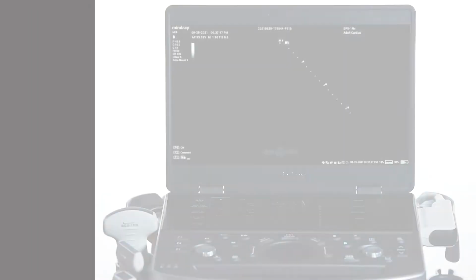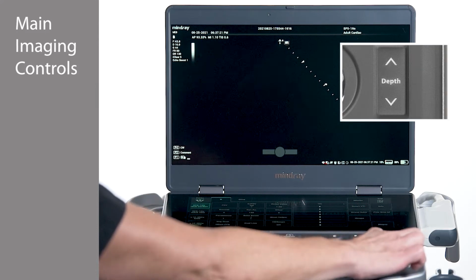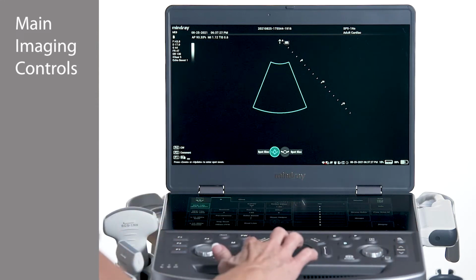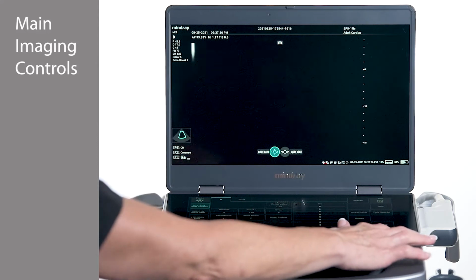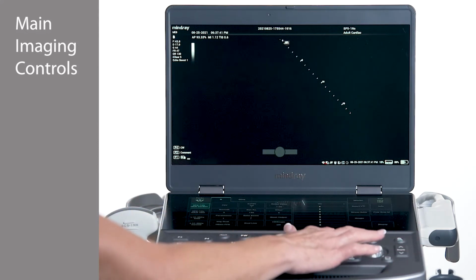On the right side of the ME8 control panel is a depth toggle and overall gain control knob. Above the depth toggle is a zoom key. After pressing zoom, use the touchpad and set keys to the right and left of the touchpad to adjust the position and size of the zoom box. To activate the zoom feature, press the zoom key, and to exit zoom, press the B mode key.